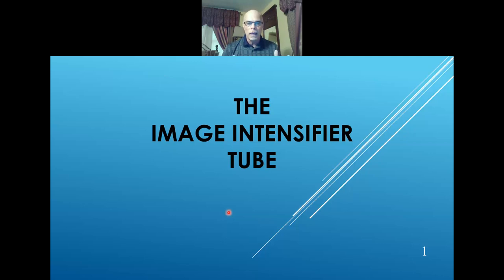the table. And the big, huge carriage that we pull over, like I talked about in the first part of this, about the introduction of the image intensifier from fluoro. So you have to keep in mind that the tube is under, and the carriage that we pull over the table is actually what we're going to be talking about today. It's a huge, big tower. We call it the fluoro tower, actually. But what I've done is I've found some schematics, and before I get into the actual chapter, I want to just go over it, and I hope this will help you understand it a little bit better.